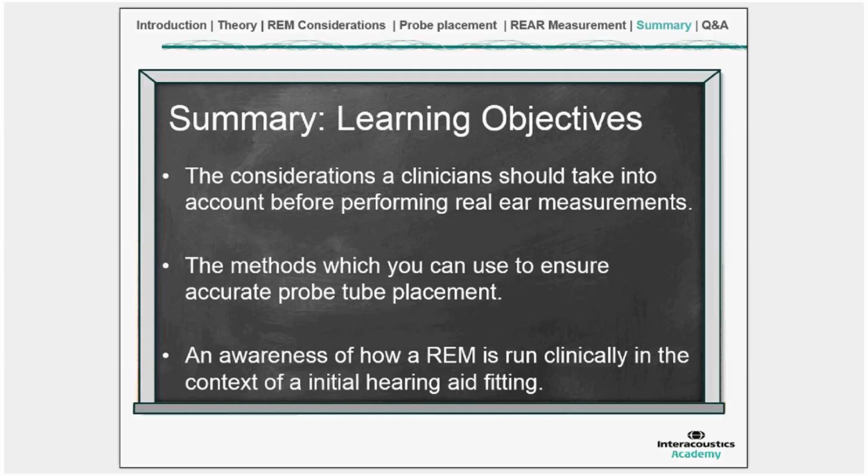Then lastly, we showed you how you do a real ear aided response measurement in the context of initial hearing aid fitting, and I'd encourage you to re-watch this video if you have any queries, and of course we have opportunity for questions now. And I'm pleased to see that there's some questions appearing on the screen, which is great.